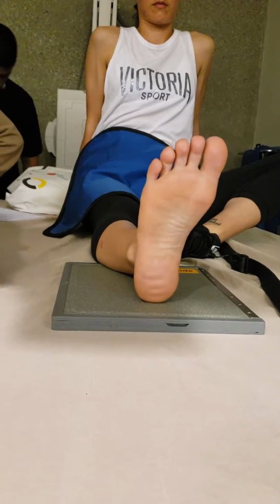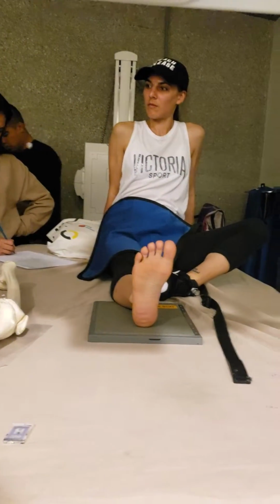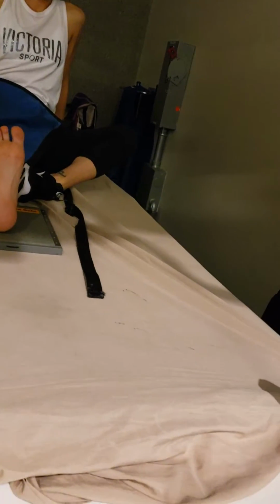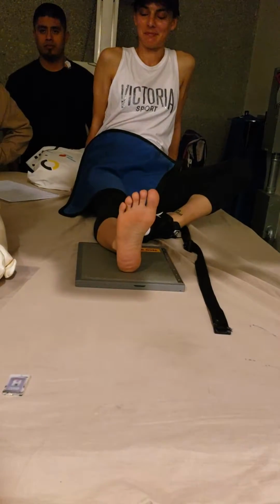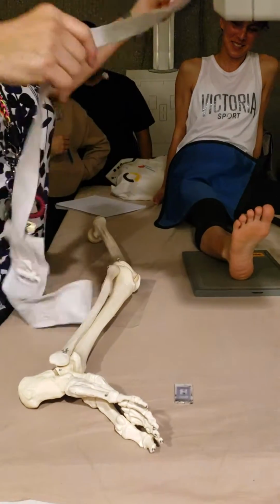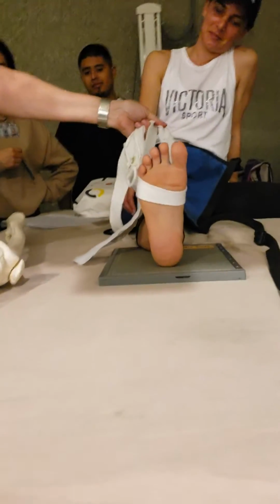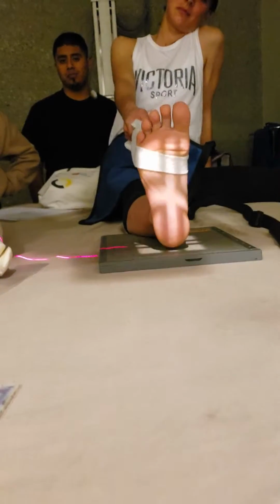Now, relax your foot for a minute. Hold on, I've got to get in here. So she's not able to flex her foot back, which probably most of you can, but if you've had a shin splint or, you know, you've had trouble with gastrocnemius tightness or whatever, we've got these different straps in here that you can use. You could use tape, or they have these Posey straps where you just put it around the foot and then have the patient gently pull back. I think most of you could probably hold it, but if you can't, just get a strap or something to help the patient. All right?